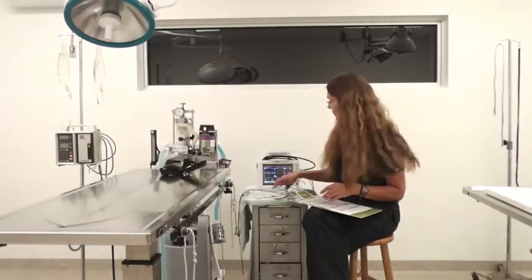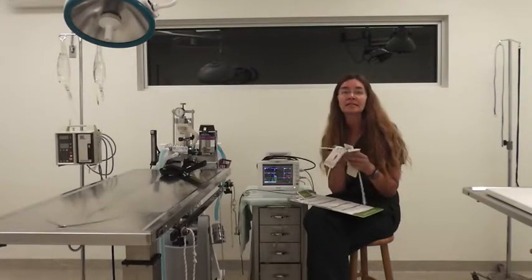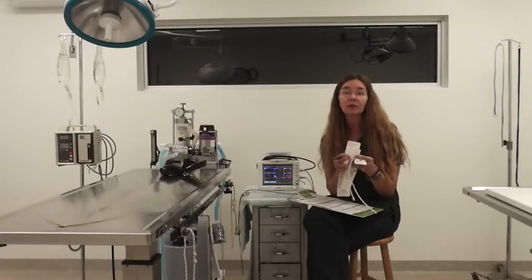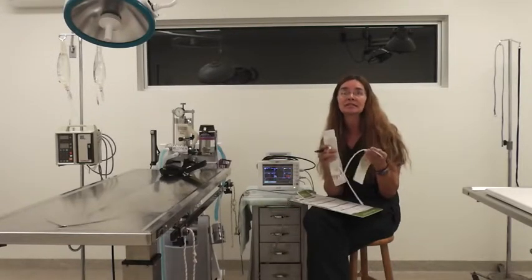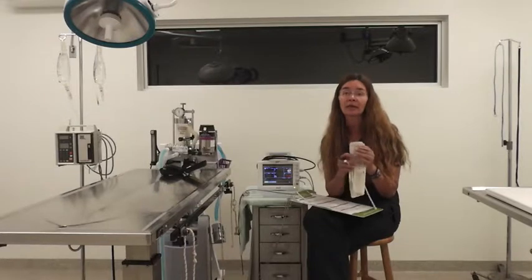Talking about blood pressure, we have our little machine here. We have blood pressure cuffs that we put on, and this is an indication of perfusion. We want a strong blood pressure. Anything below 60 millimeters of mercury indicates a decreased flow to organs, and we need to correct that right away.